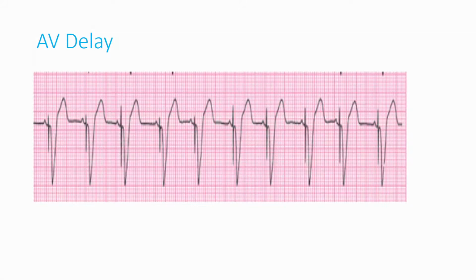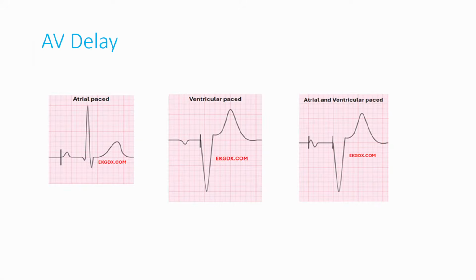So here again, though you give a dual chamber pacemaker, an AV synchrony pacemaker, you are still losing that AV synchrony. These are small parameters which we need to take care of. Either you pace AV or sense AV, but you need to give a PR segment. The PR interval is very, very important. Anand had actually mentioned that somebody was fatigued and tired. You know, why is that so?